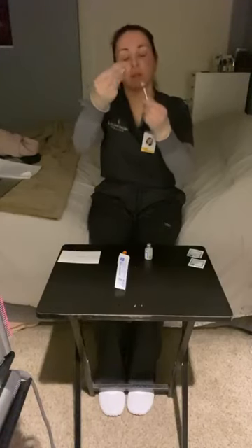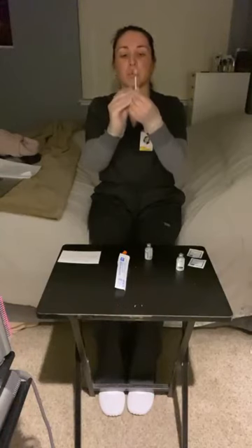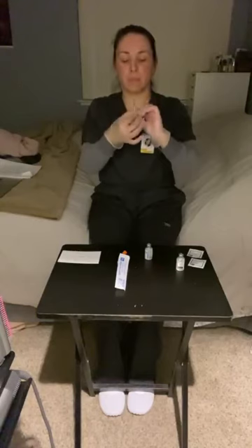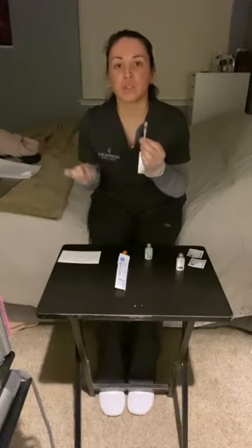I'm going to remove the vial. And I'm going to tap on the syringe to release air bubbles and push gently on the plunger to release the air bubbles. I'm now going to verify the 4 units against the MAR EHR.